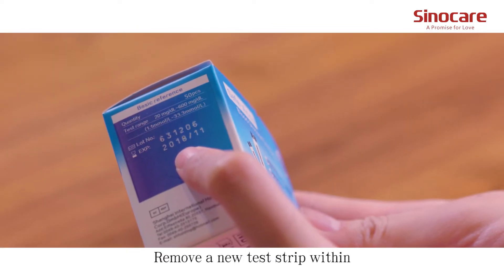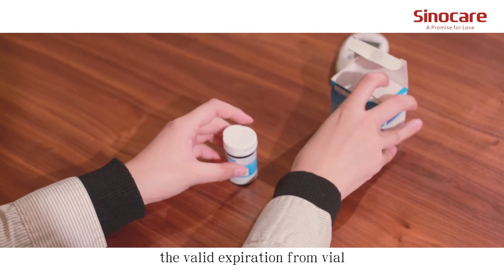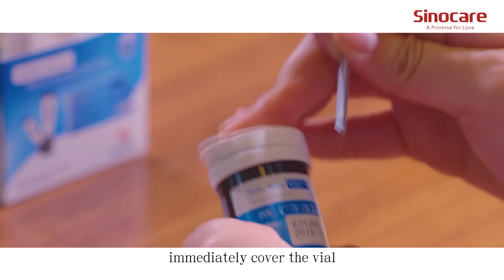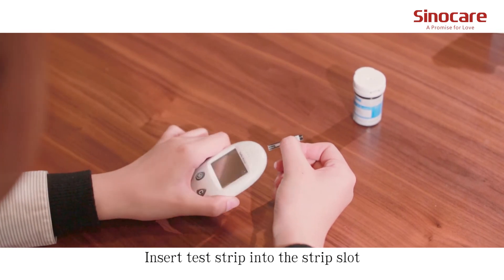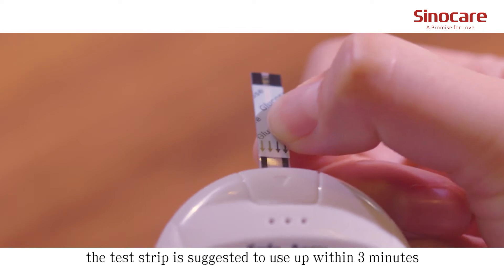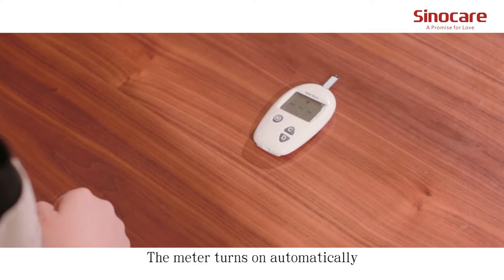Remove a new test strip within the valid expiration date from the vial. After taking the strip, immediately cover the vial to avoid losing efficiency. Insert the test strip into the strip slot. The test strip is suggested to be used within three minutes. The meter turns on automatically.